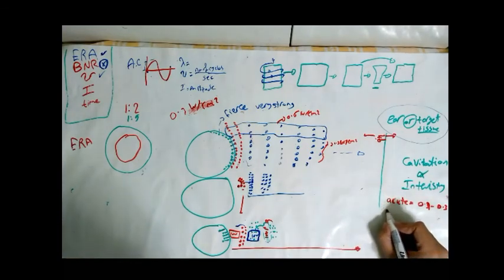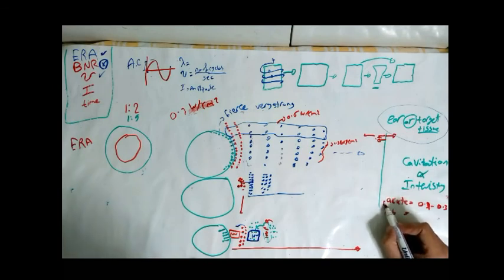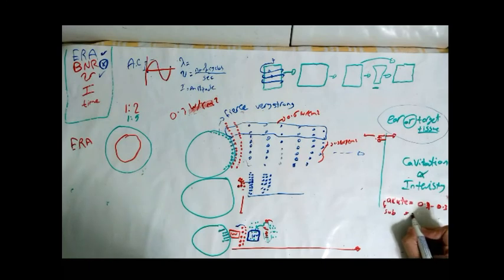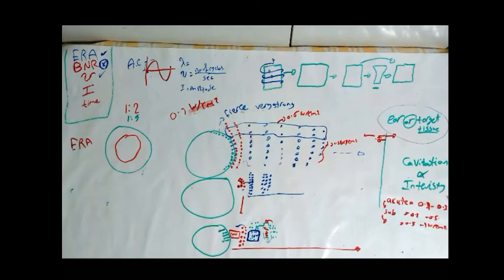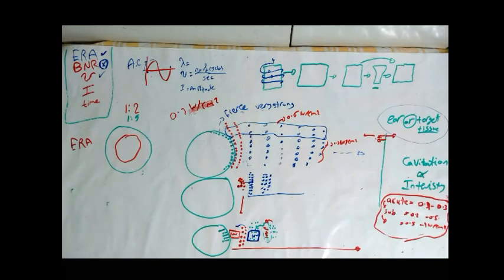In the subacute stage, soft tissue is now stronger than in the acute stage. So I use 0.2 to 0.5 watt per centimeter squared. In the chronic stage, I use from 0.5 to 1 watt per centimeter squared. Remember this point because we need it when I'm going to use the parameters of ultrasound.